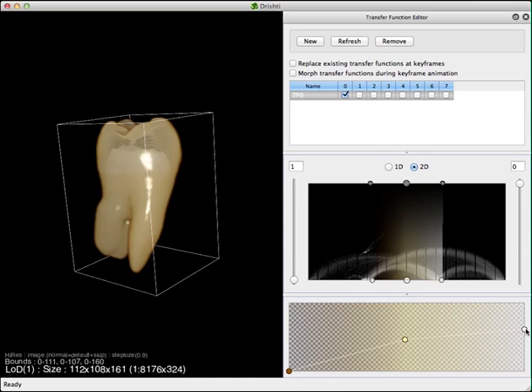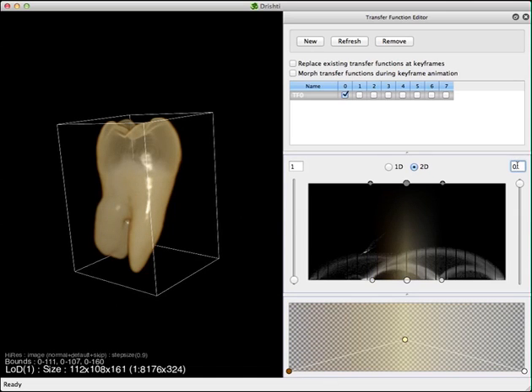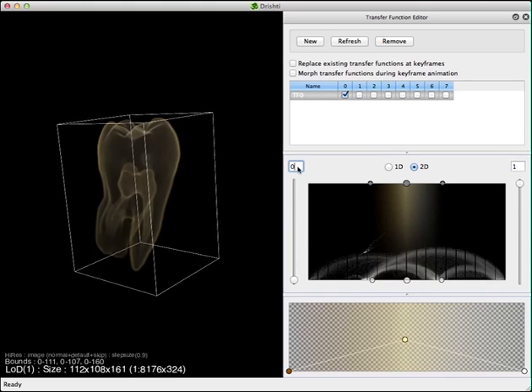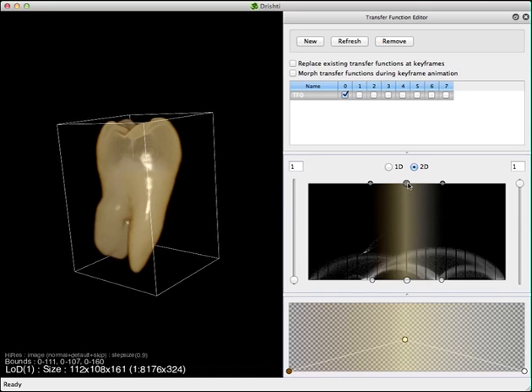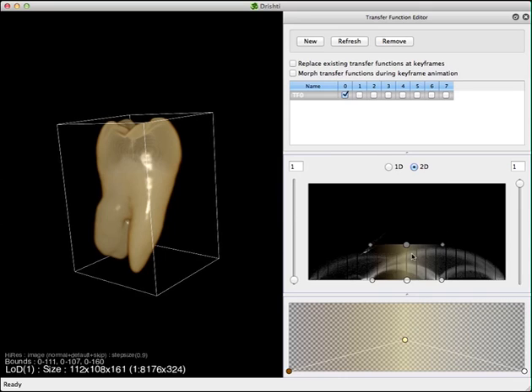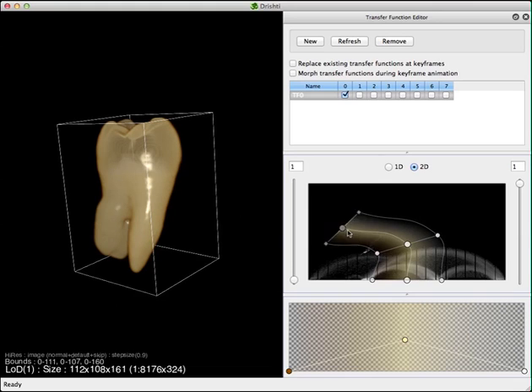If I change this number it changes the opacity for the initial first point. Now let me set it to one. Use left-click to add a point and right-click to remove a point. I've added a point and moved it around.